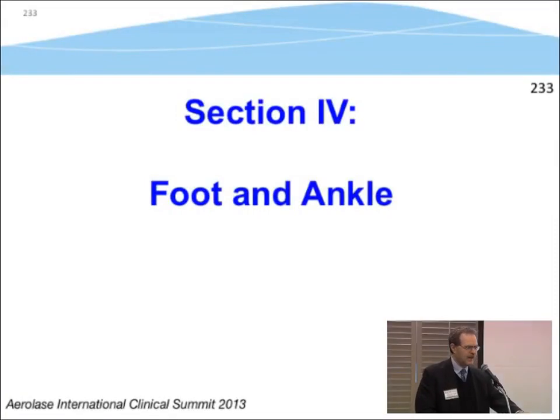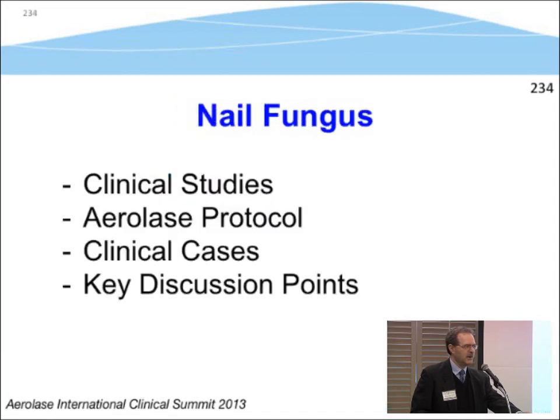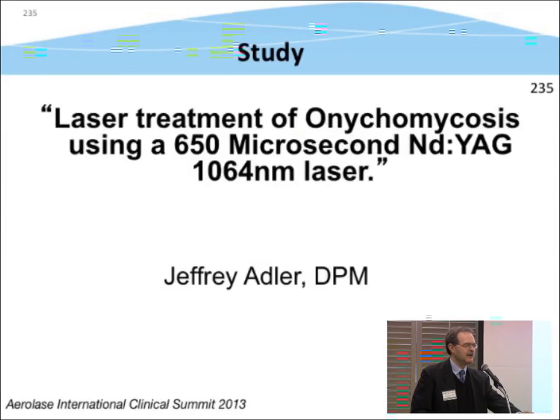Basically, I've been involved with the laser in podiatry for about 30 years, starting with the CO2 laser back in the mid-80s through an organization called the International Society of Podiatric Laser Surgeons. And there were more urban myths about lasers in podiatry than anything. At that time, a lot of practitioners were using the CO2 laser to ablate a nail plate that was mycotic.